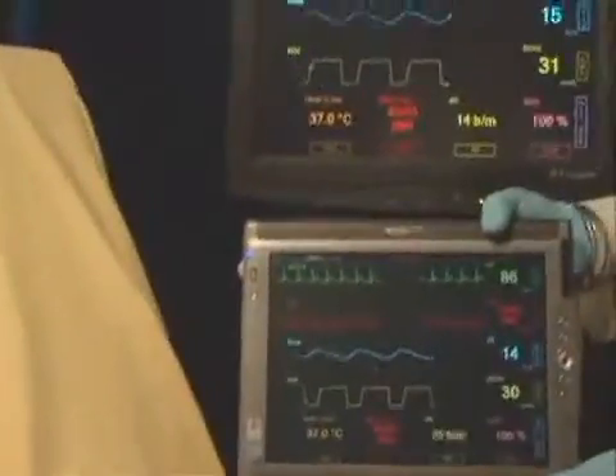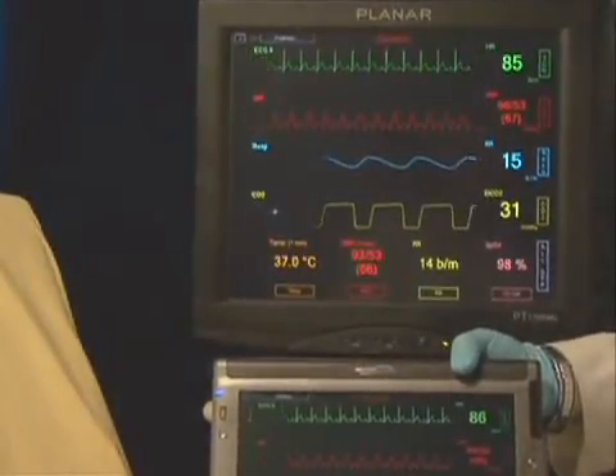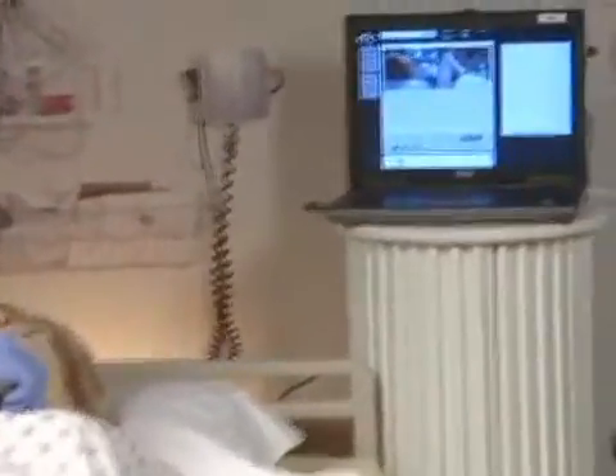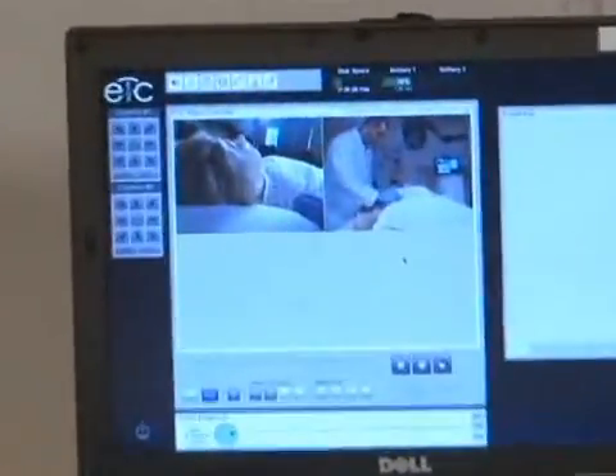For additional realism, virtual vital sign monitors are available in both fixed and mobile formats. The simulation experience can be enhanced with the use of a compatible audio-visual system, like KB Port, Beeline, and EMS.